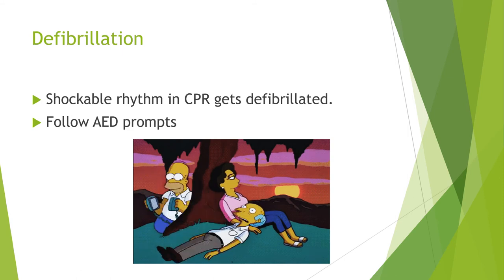You're going to continue CPR for another 2 minutes. ALS providers may administer epinephrine or other medications. Defibrillation is for a shockable rhythm in CPR. You're going to follow the AED prompts.